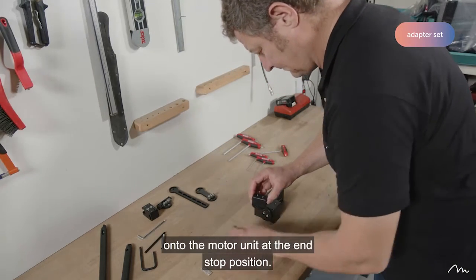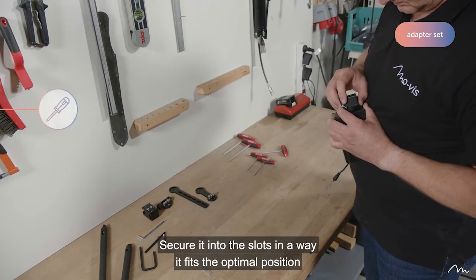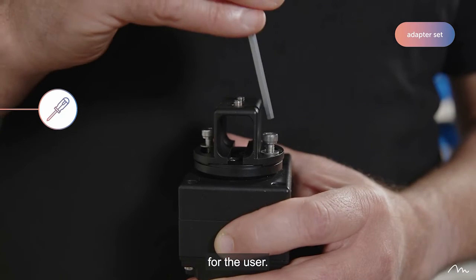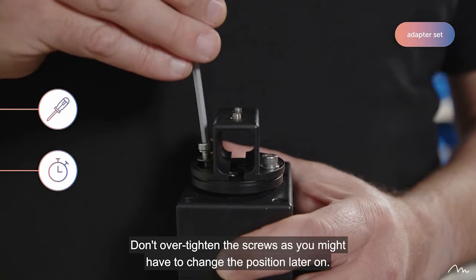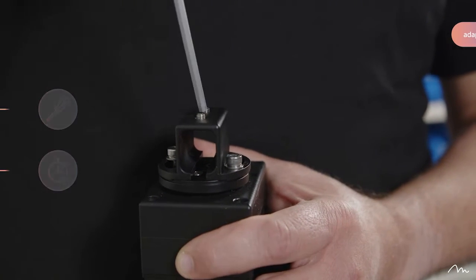Place the adapter set onto the motor unit at the end stop position. Secure it into the slots in a way it fits the optimal position for the user. Please note that this is still a preliminary fitting. Don't over-tighten the screws, as you might have to change the position later on.